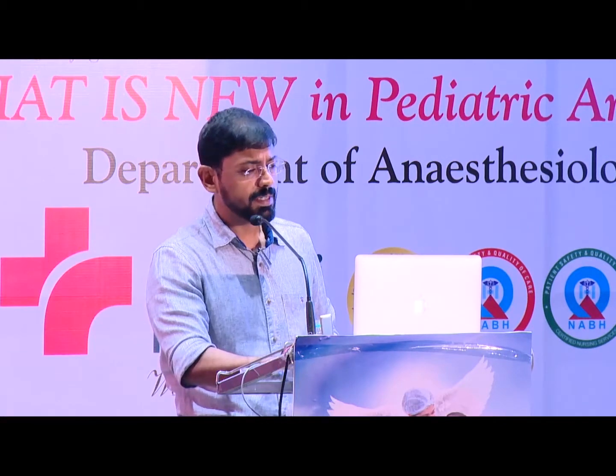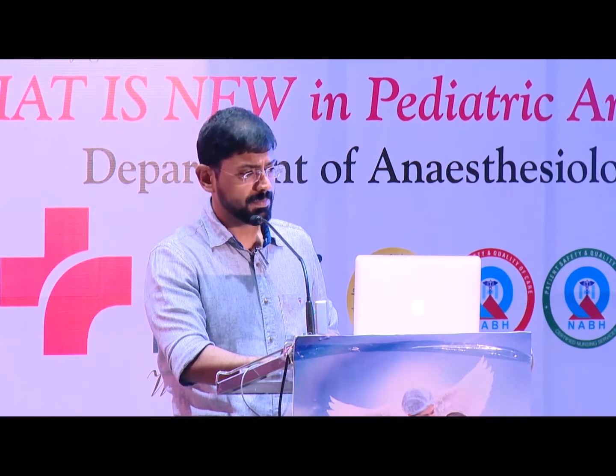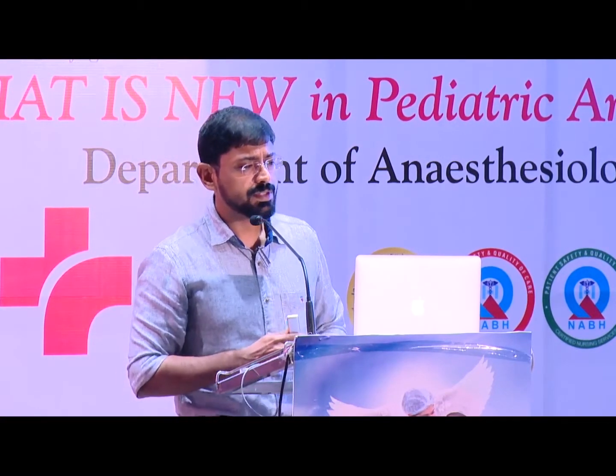So in short, the ventilator delivers the same parameters we have set. He's nice and sedated, not taking any spontaneous breaths. There is adequate chest rise, and his vitals are stable. Some questions at this stage.